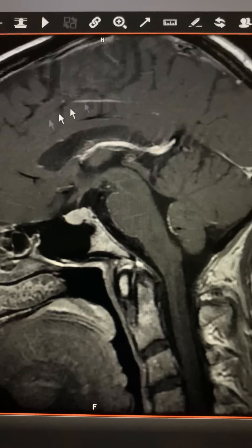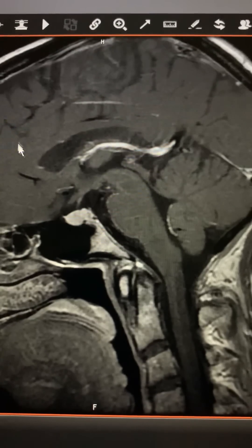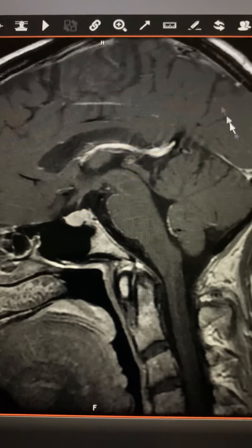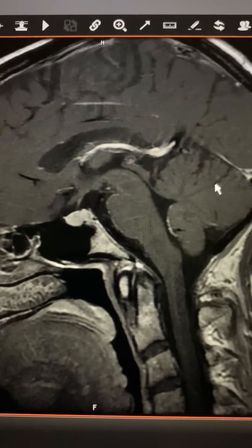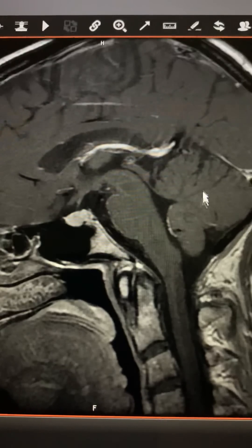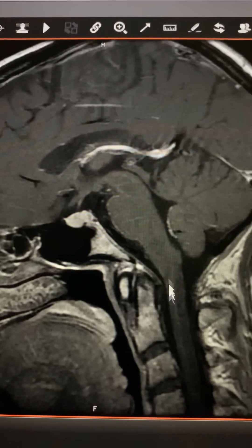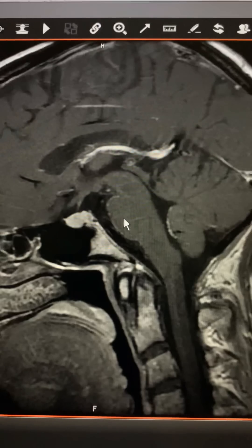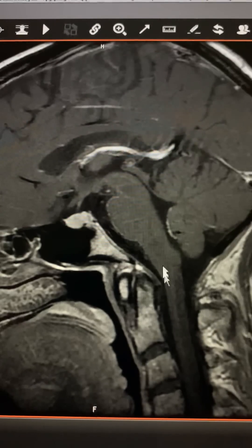This is the cerebrum — the main part of the brain, the frontal occipital part. This is the cerebellum. This is the brain stem. This part is the pons, and this part is the medulla.